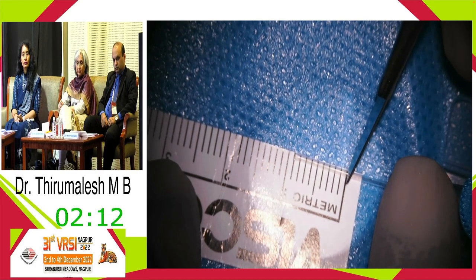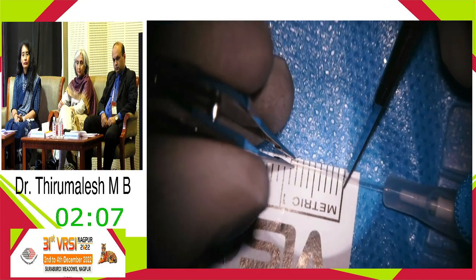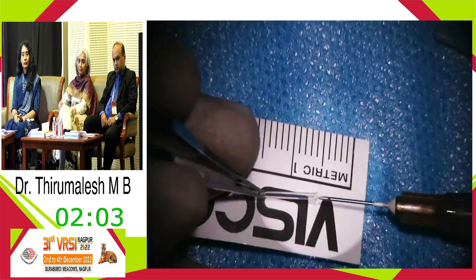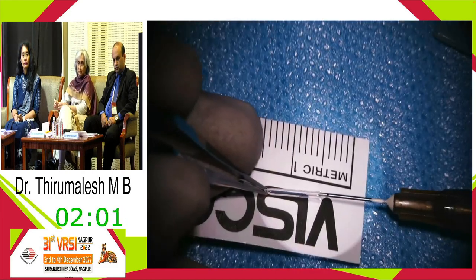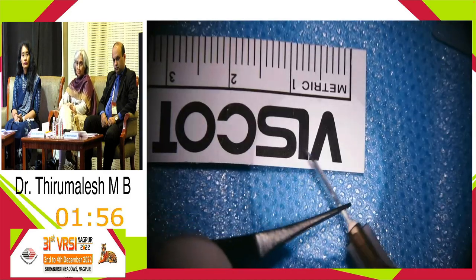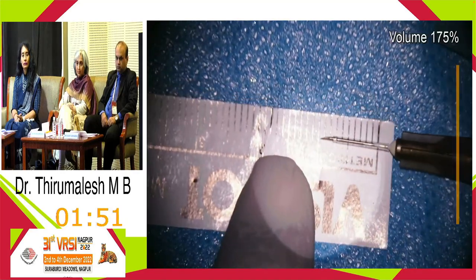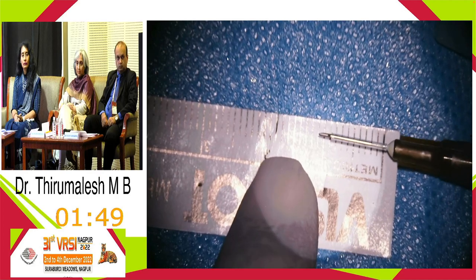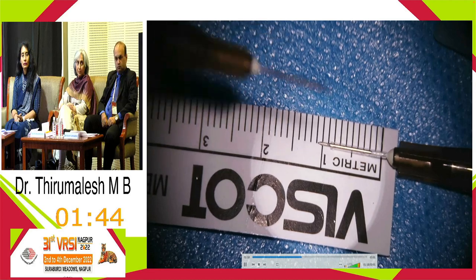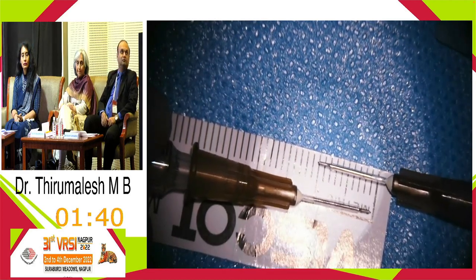Care should be taken for the ends to not rebound off the sterile area. Then we assemble the 9 mm long cut part of the cannula over the 26 gauge needle in such a manner which leaves 200 micron of the needle end exposed. With this technique, two suprachoroidal injections can be made from one cannula.